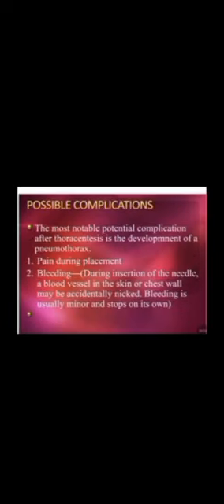Tumors sometimes spread to the lungs or pleura, the lining of the lung and the chest wall, and can cause fluid to build up in the chest. A thoracentesis may be done to help make the diagnosis. Fluid that is drained can be examined in the laboratory to see if cancer cells are present. This type of pleural effusion is called malignant pleural effusion, the term MPE.